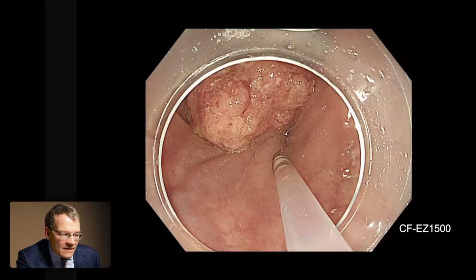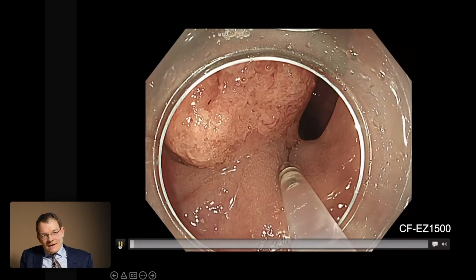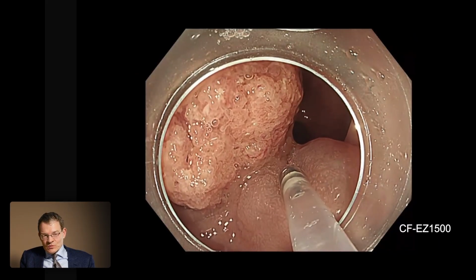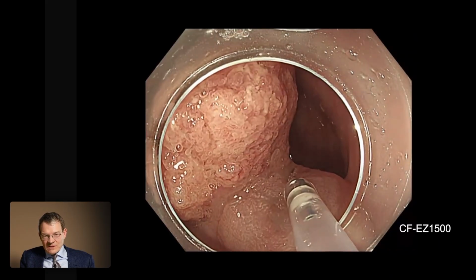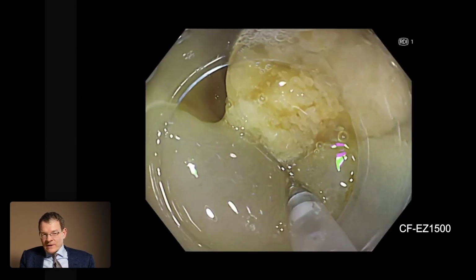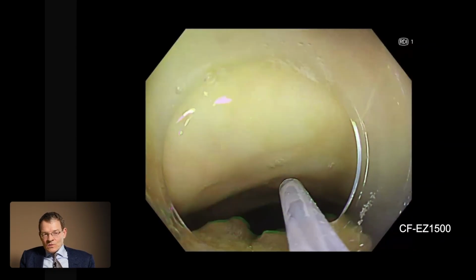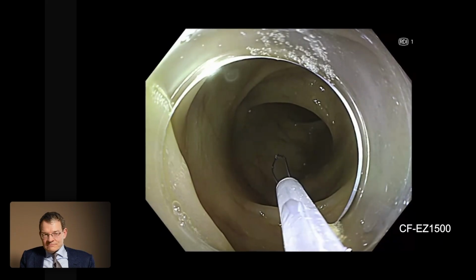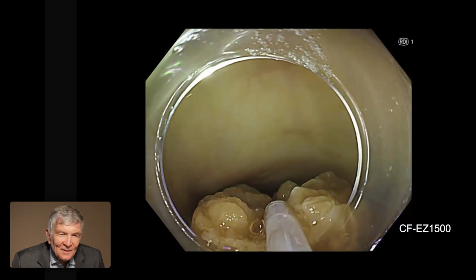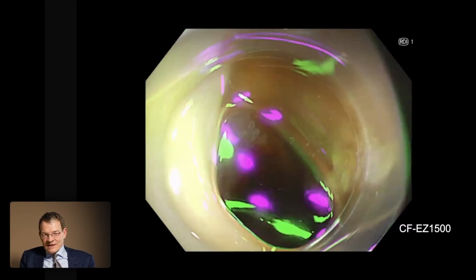Then this is another example. Here this is a very special malignant polyp, and finally we decided to resect this polyp because the polyp still had a good lifting. But in such a situation we expect already a heavy bleeding after the polypectomy. So yes, here I switched immediately to the RDI filter, in expectation of bleeding. In expectation of bleeding, exactly. And now, after the resection, definitely it started to bleed.